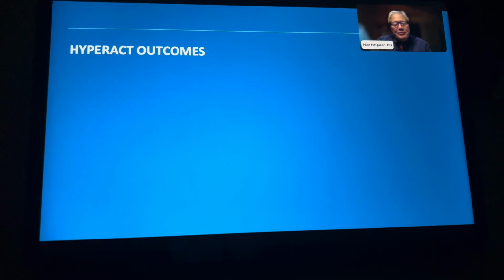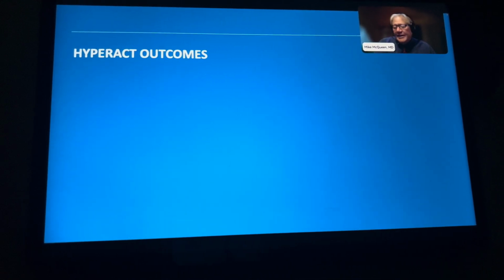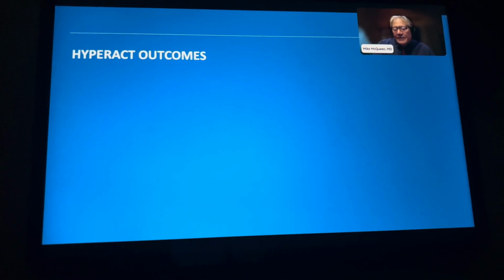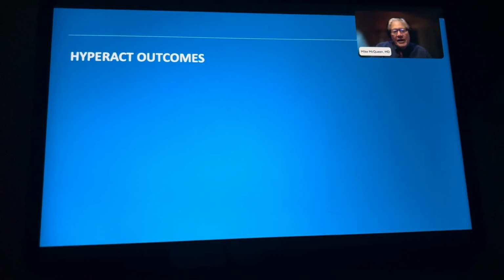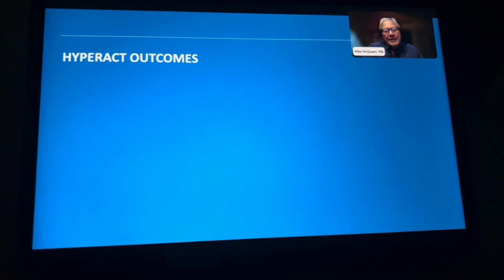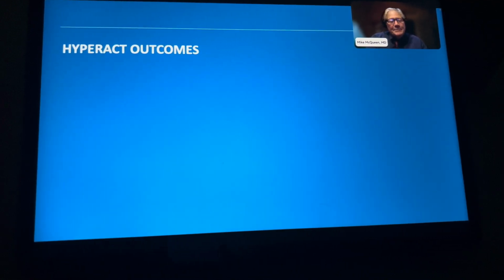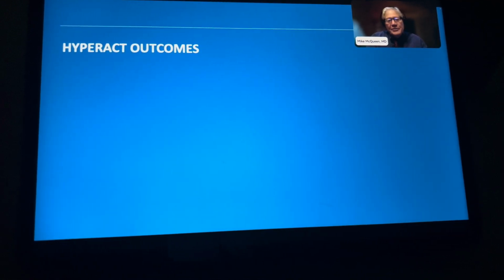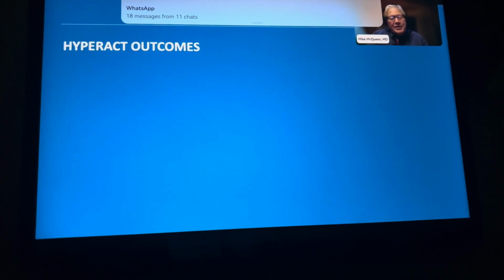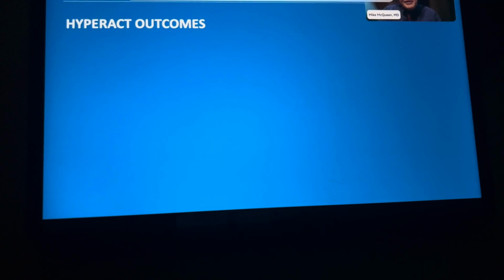The CO2 baseline was 78 in one group, 77 in the other group. This is truly a hypercapnic trial, which leads me to think that a lot of your investigators must have said, no way. There's no way that a nasal cannula is going to be able to treat severe hypercapnia. We've gotten comfortable during COVID using the device for hypoxemia, but there's no way a nasal cannula is going to be able to match up to positive pressure ventilation for this degree of hypercapnia.